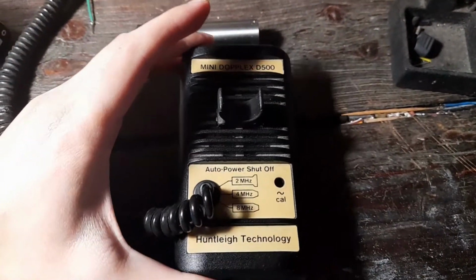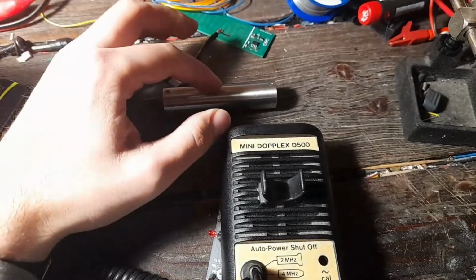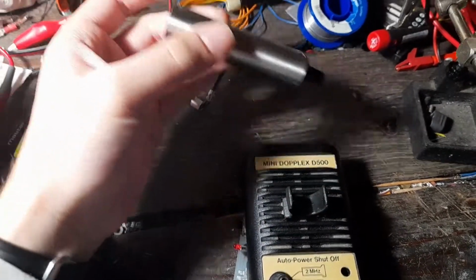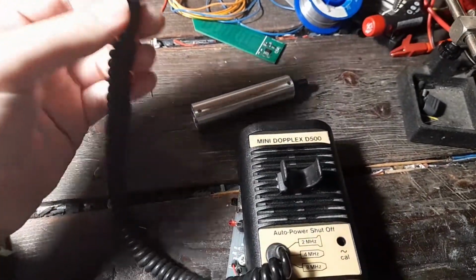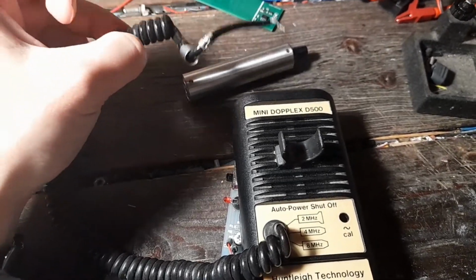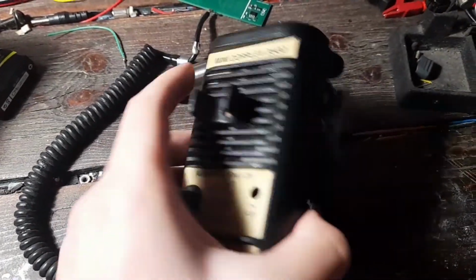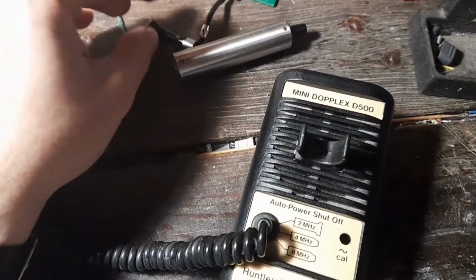The problem with this unit was that it had a very weird behavior: when it was turned on, it offered the output of the transducer intermittently. It was very weird, because the first thing that came to my mind when this problem appeared is that it was something wrong with the cable. Even if you shook the cable, it didn't seem to fix it. It was just random, and I tried to move it, shake it around, and it didn't help either.